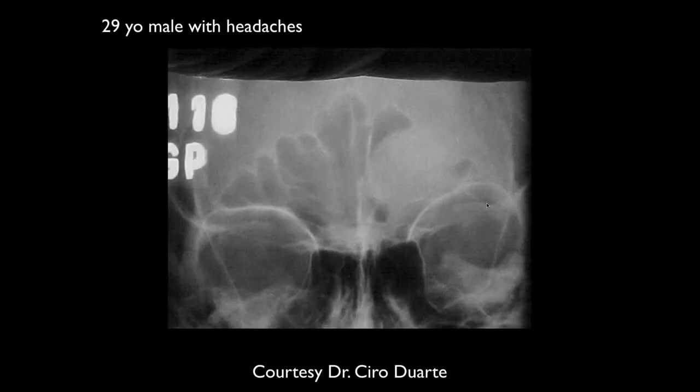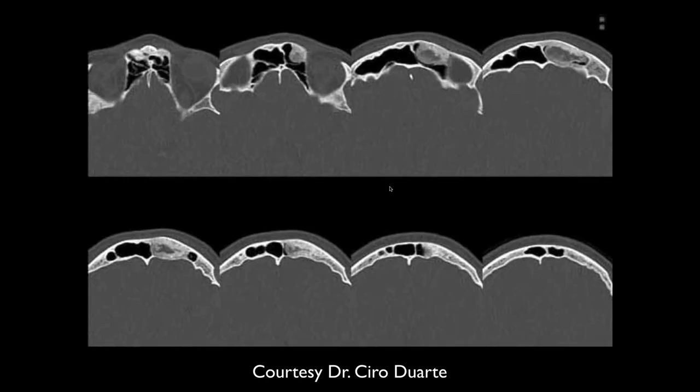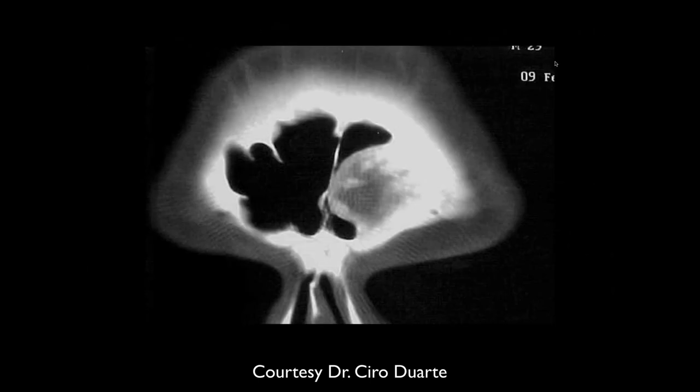Okay. Sahar. Okay, 29-year-old male with headache. Maybe there's some opacification of the left frontal sinus. It looks like there's a mass-like lesion there. I see a benign appearing, well defined mass arising from the left frontal bone protruding into the frontal sinus. I'm thinking of osteoma.